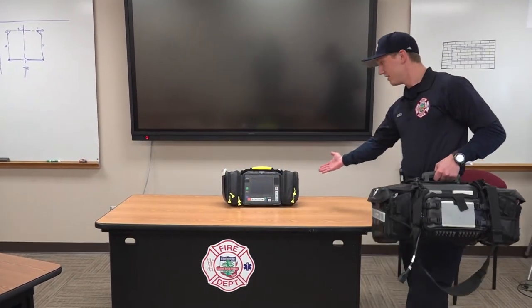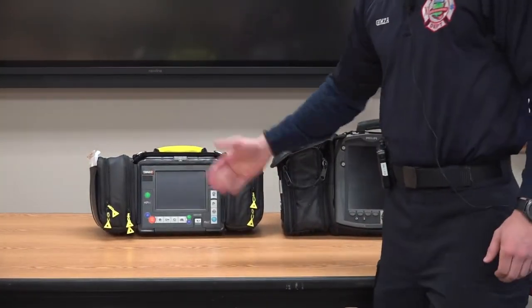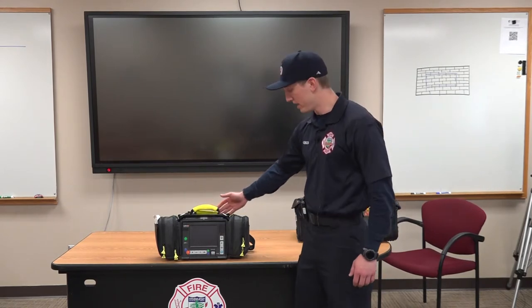Behind it you can see that this is our Tempest monitor. Compared to the old monitors that we have, the Tempest monitor is smaller. Our new monitor, the Tempest Pro, comes in two features: the monitor here and the defibrillator on the back.